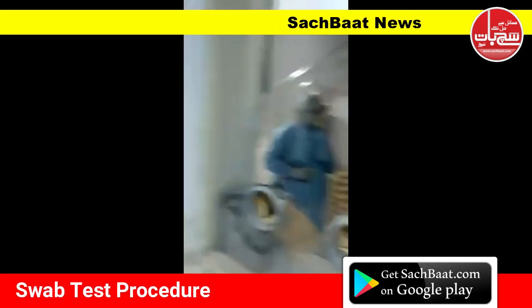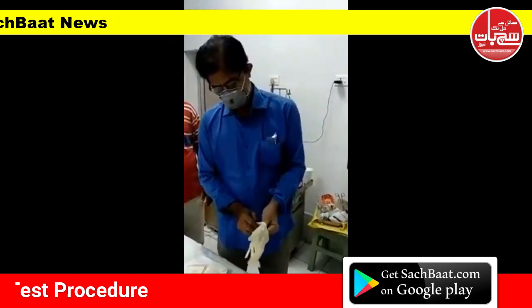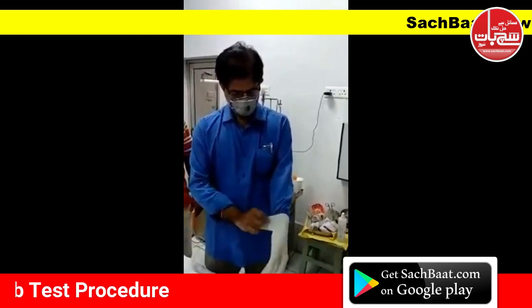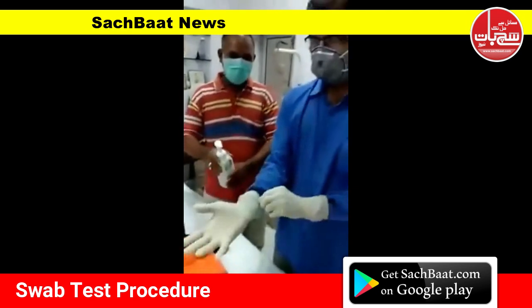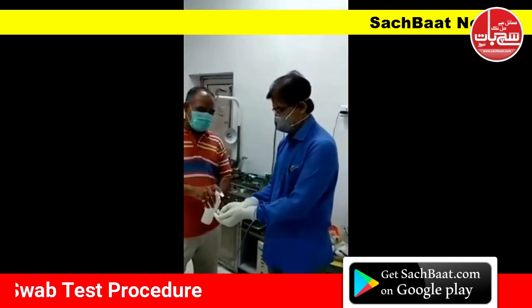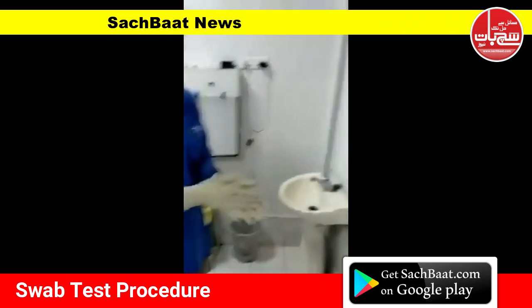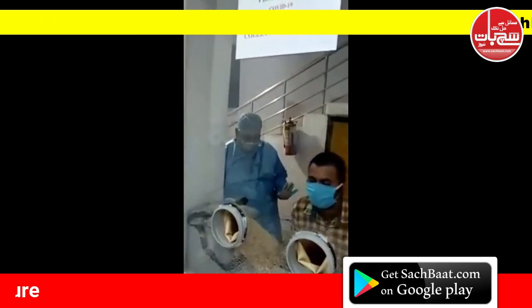This is the second case for which the sampling will be taken by Dr. Ravikant. He is getting ready, sanitizing the hands with sanitizer. The patient is also ready and has been sprayed another time.